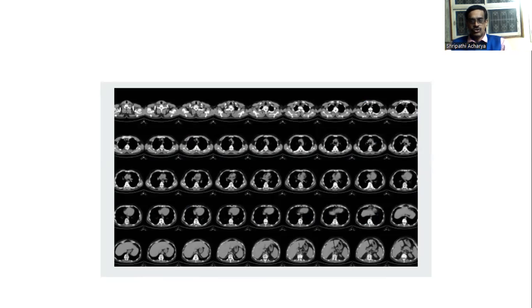Prior knowledge of anatomical configuration of the body is necessary to detect the pathology of the body organs in CT scan. You should know the principles of X-ray also and tomography, and also you should know the anatomy perfectly, so that you can assess the type of abnormality and extent of damage.